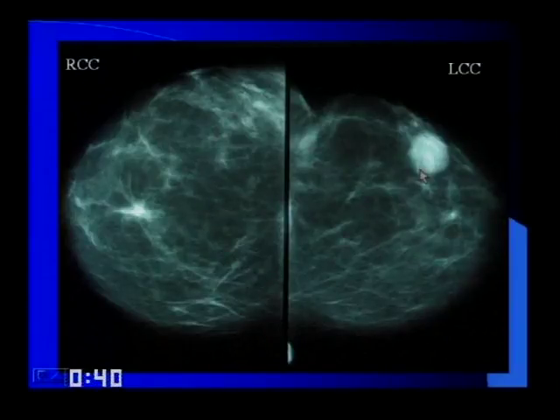if this lesion appears to be very well marginated, I wonder if it may be a cyst. I'd do an ultrasound to further evaluate it. Okay. What are you going to do first? Additional mammography. Well, physical exam, obviously, since she's here for a diagnostic mammogram. If she has a palpable lesion, she's not just a screener. And then she's going to get some spot radiography of it.